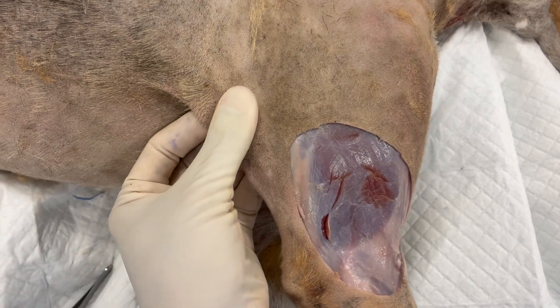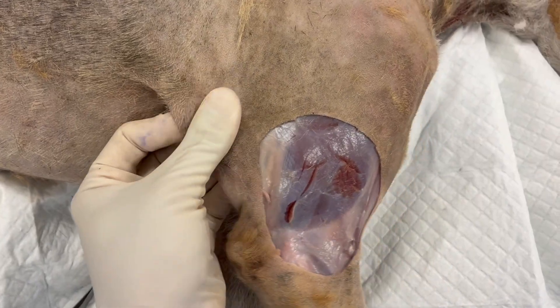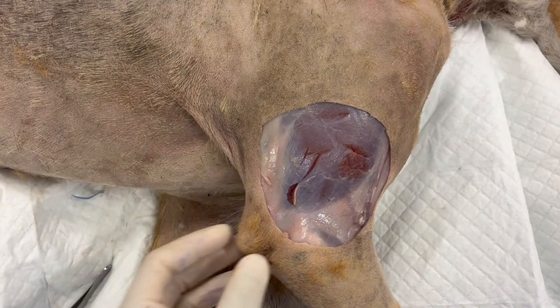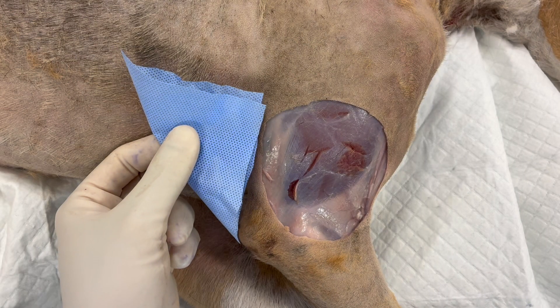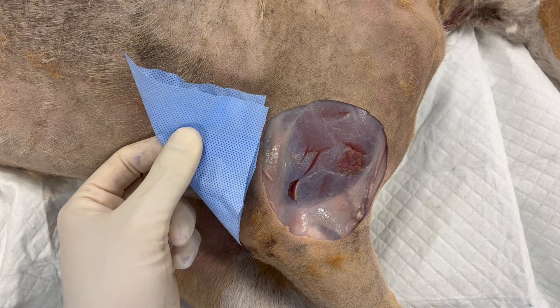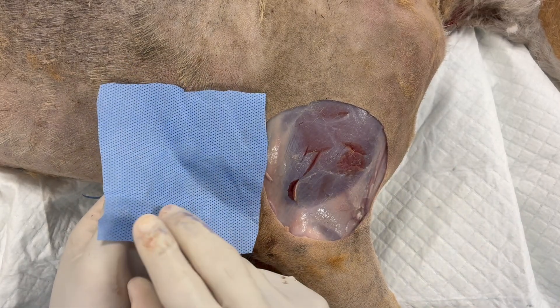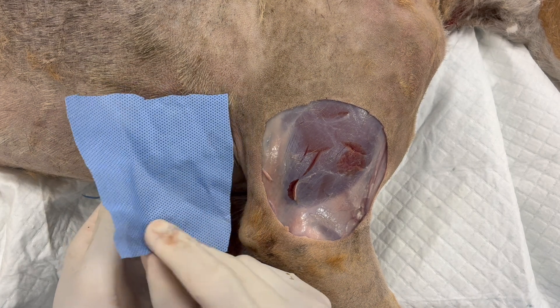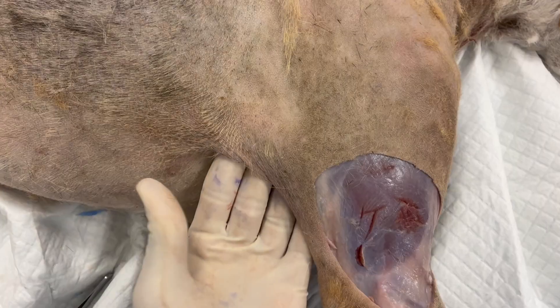With the elbow fold there is this extra skin that we can use to cover any defects in the area. You can think of the elbow or the flank fold as a square piece of skin that's folded in half with medial and lateral surfaces, and you can free up this tissue with a pedicle and advance it into a defect.